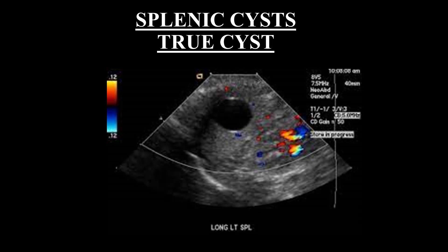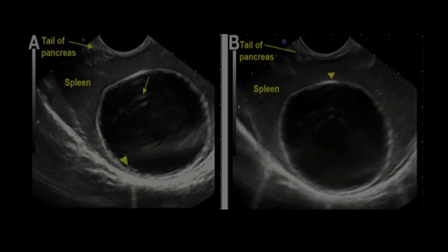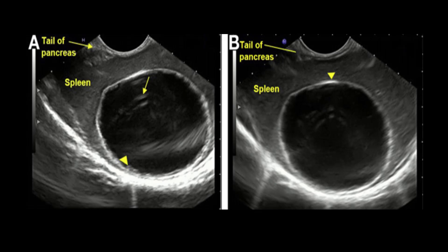Cystic splenic masses include primary simple cysts, which are rare, hemorrhagic cysts, hematoma, abscess, pseudocyst, splenic artery aneurysm and pseudoaneurysm, and cystic metastasis. A true simple cyst of the spleen will appear as an anechoic, well-circumscribed cystic lesion within the splenic parenchyma with posterior acoustic enhancement. A pseudocyst could be an old hematoma or old hemorrhagic cyst; sometimes it has calcification, as shown in this case with wall calcification.